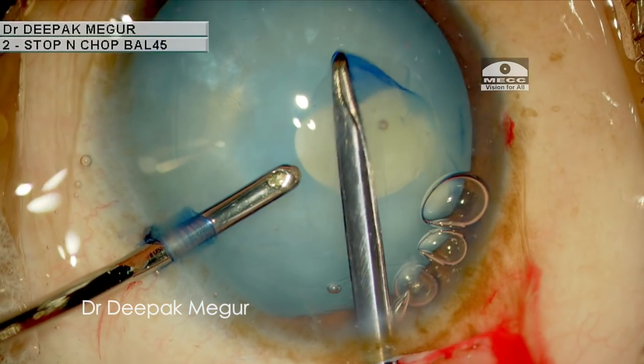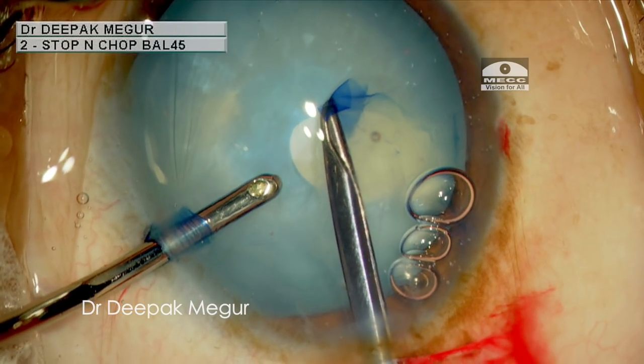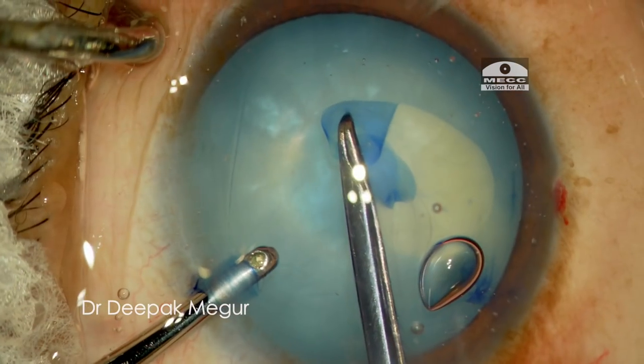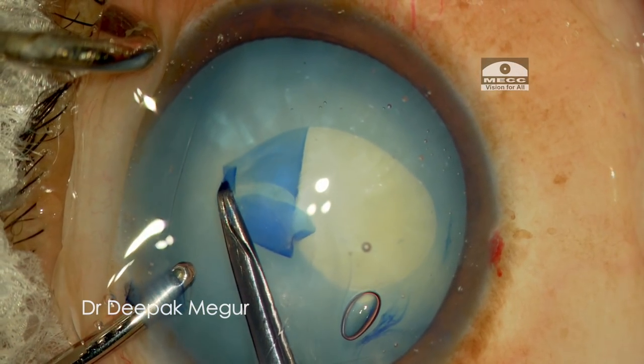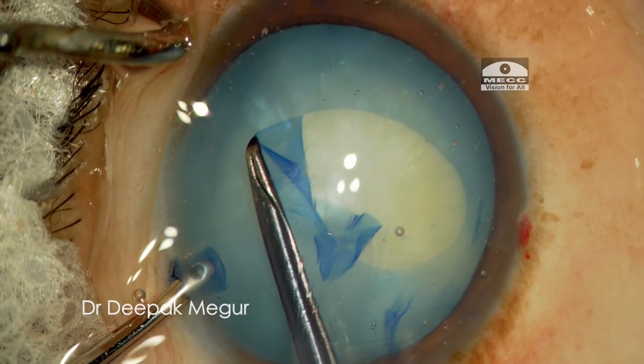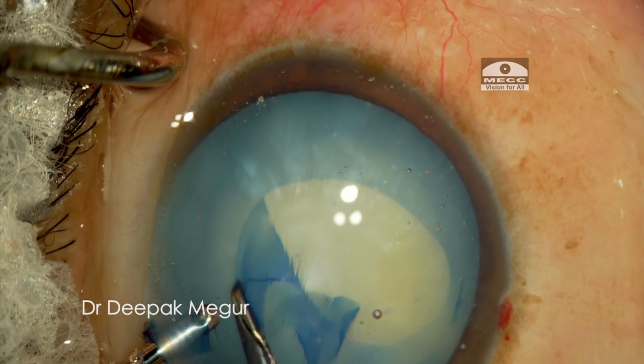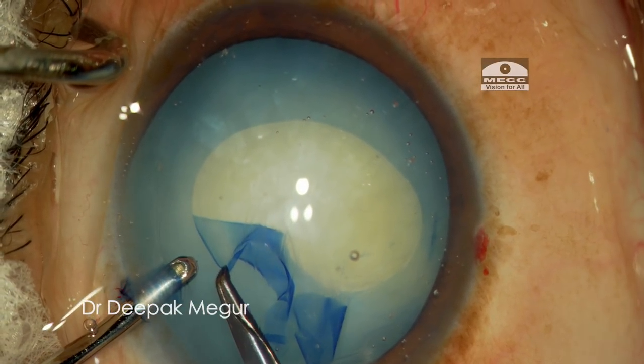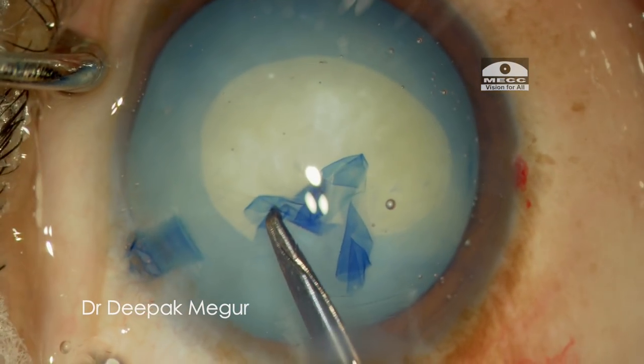Having crossed the danger zone, I am still careful but now aiming for a bigger rhexis. Thankfully the plan worked well, and I ended up with a curvilinear rhexis — although eccentric, it still serves the purpose pretty well.